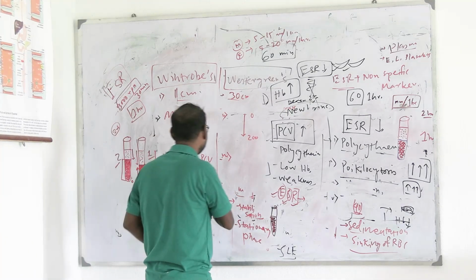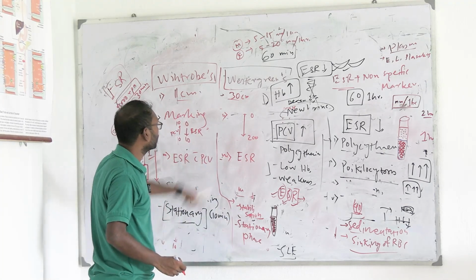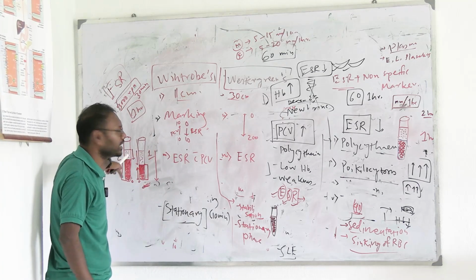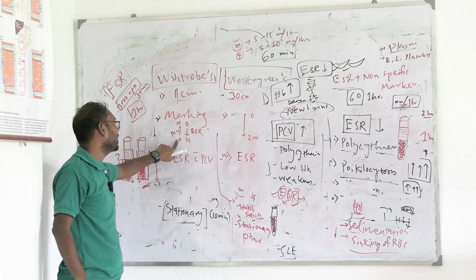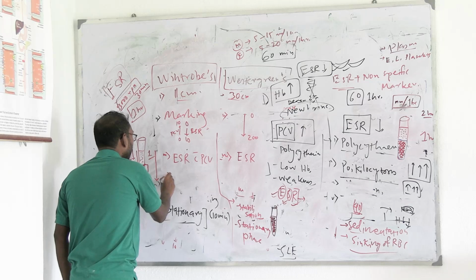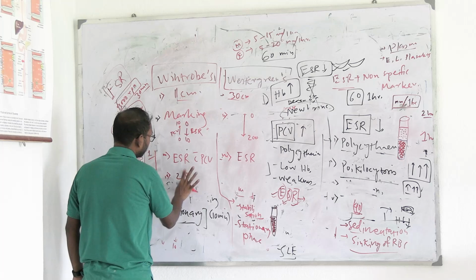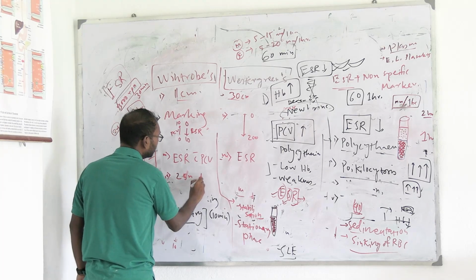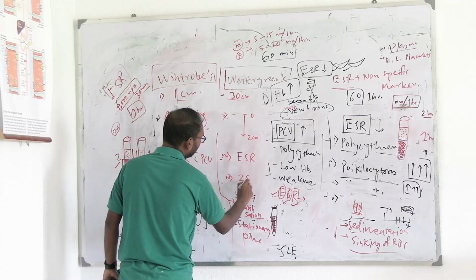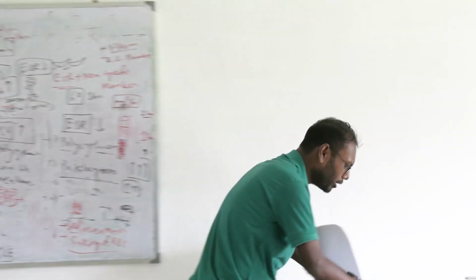So in this case, the third difference is you can measure only ESR, but in this case you can measure both. That's why the markings are only down below, because we will only look at ESR, and here I said we look at ESR from above to below, but in this case the markings are both ways in case I want to assess the PCV. Okay, now what will the fourth point be? The diameter is the same in both cases, 2.5 millimeter diameter, right? In case of these also, the interior diameter is the same, 2.5 millimeter in a glass tube.